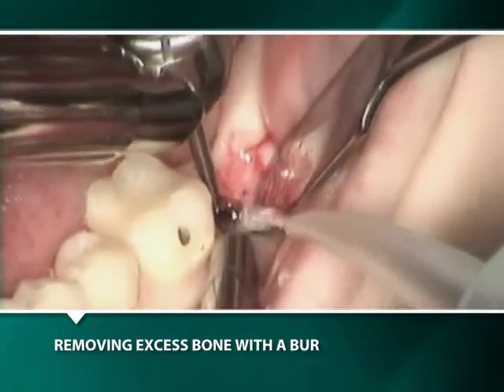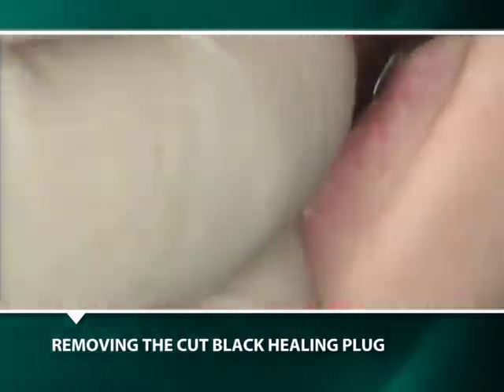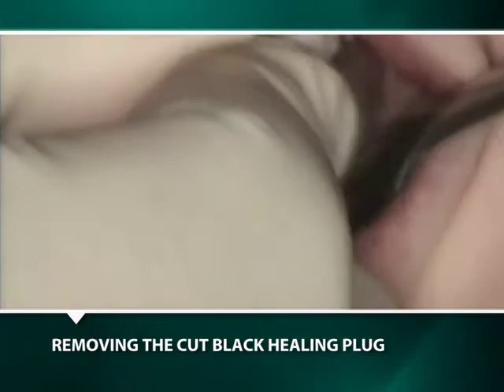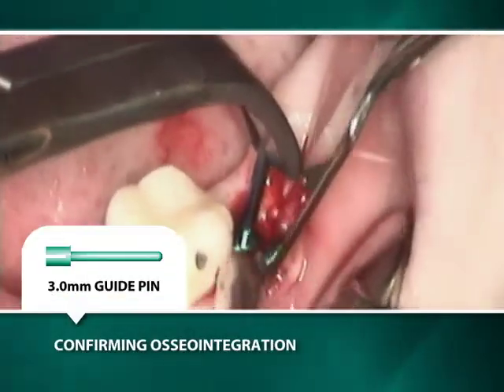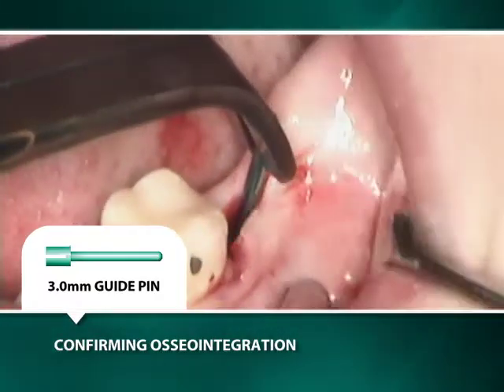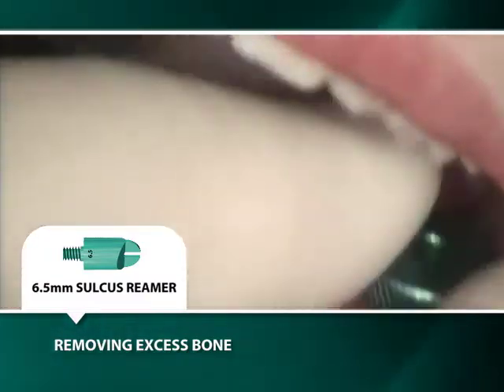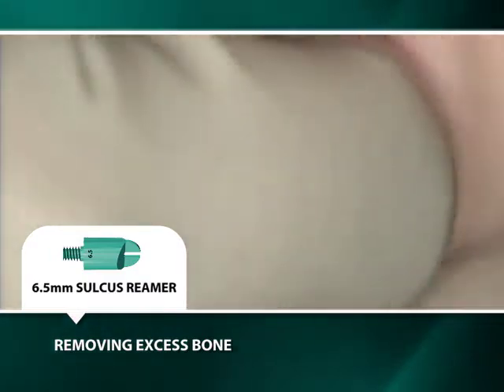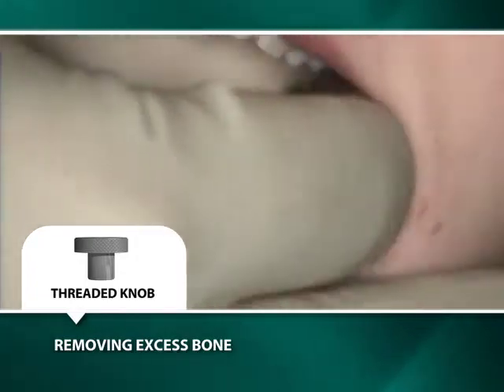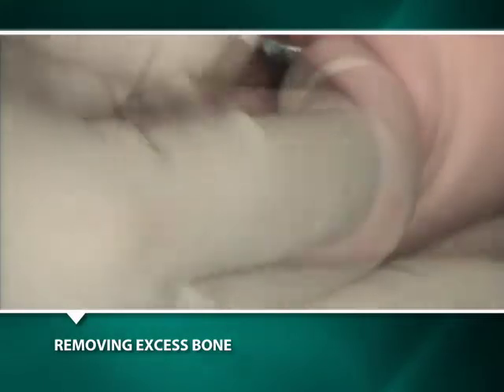Although the exposed healing plug could have been removed with a healing plug remover, a rongeur, or a C1 scaler, in this case a number 110 endodontic reamer burr is used. Integration is checked by placing a green 3 mm guide pin into the well of the osteotomy. Bone contouring over the implant is achieved by placing and rotating a green 6.5 mm sulcus reamer attached to a threaded knob onto the seated guide pin. This contouring facilitates the insertion of a corresponding 6.5 mm abutment.